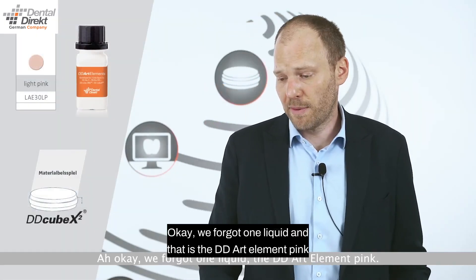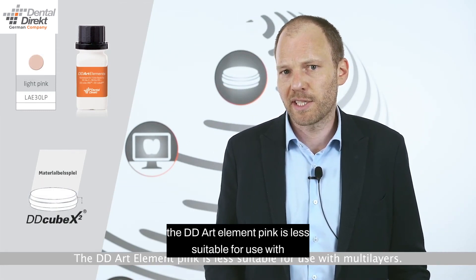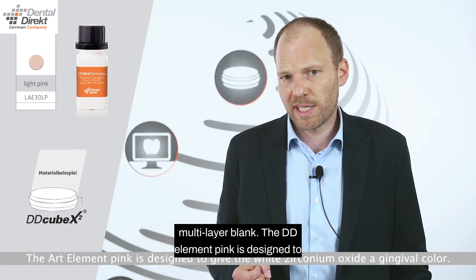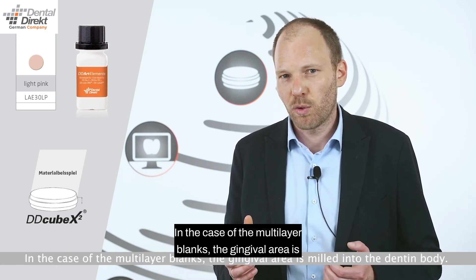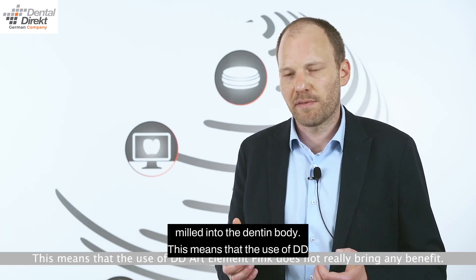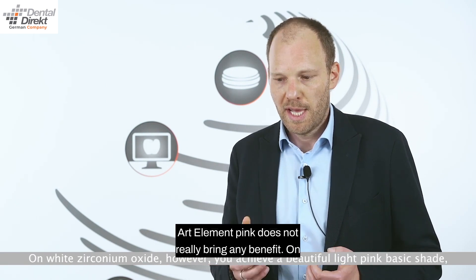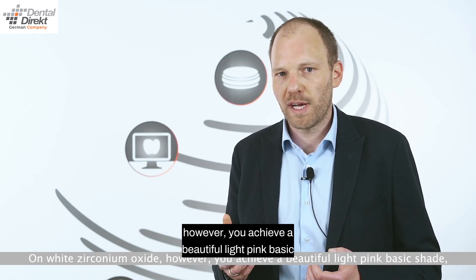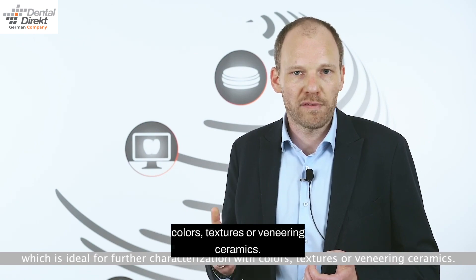We forgot one liquid: the DD Art Element Pink. The DD Art Element Pink is less suitable for use with multi-layer blanks, as it is designed to give white zirconium oxide a gingival color. In the case of multi-layer blanks, the gingival area is milled into the dentin body, meaning the use of DD Art Element Pink does not really bring any benefit. On white zirconium oxide, however, you achieve a beautiful light pink basic shade, which is ideal for further characterization with colors, textures, or veneering ceramics.